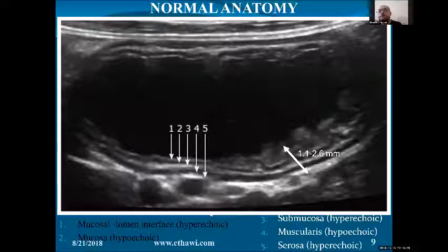Okay. If it's thin, then that means it's starting to slough. You're losing the wall, and it might lead to perforation. So when you see a thin area, you have to monitor it for evidence of perforation, in addition to other action or medical management according to the case. Yep. Okay?